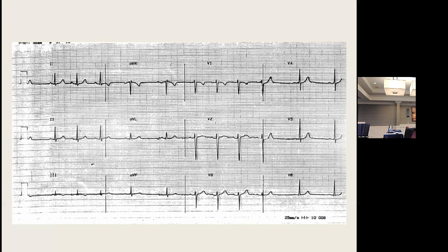Now, remember what I said about our algorithm? It's clinical context, validity, clinical context. You take this EKG, and this is not a 15-year-old. Let's call this a 75-year-old. Now we've got a different animal. Sinus arrhythmia in a 75-year-old, maybe that's the first sign of sick sinus. Maybe this is the first sign of impending pacemaker failure. Maybe this is going to be a problem. So clinical context plays all the role with EKG interpretation. And here, this is the rule in children. This would be abnormal, not necessarily pathologic, but abnormal in an older adult.